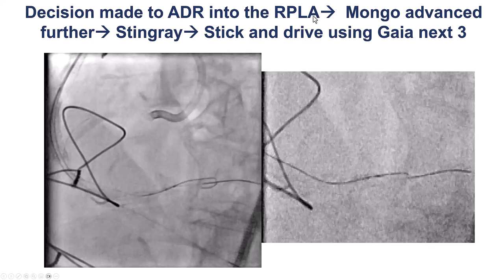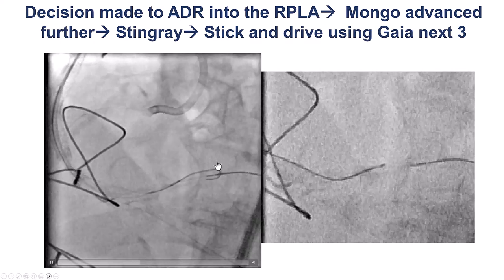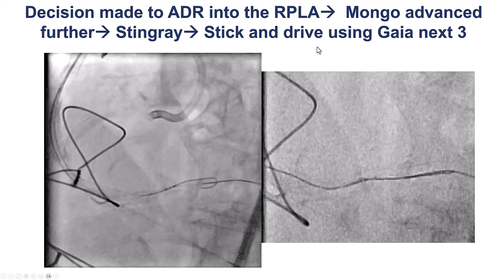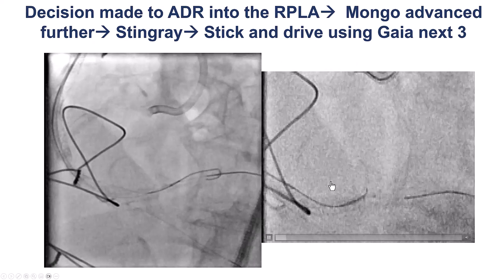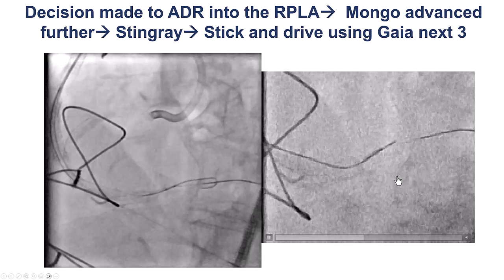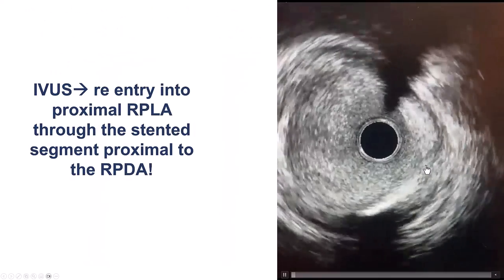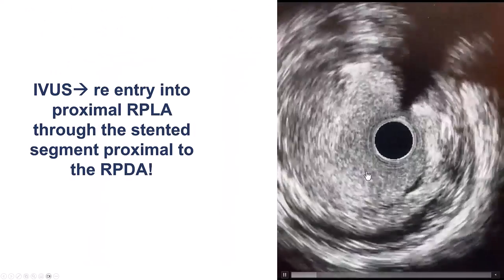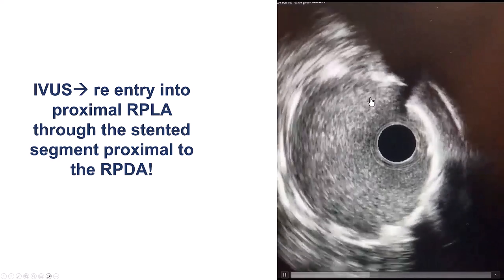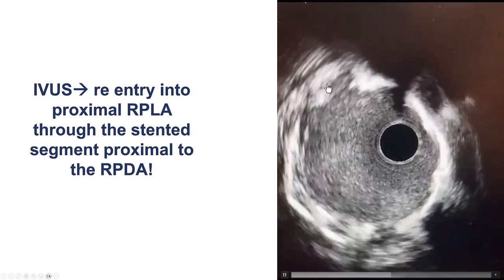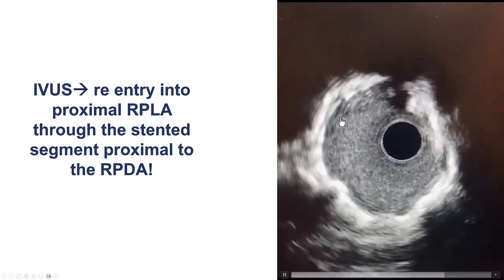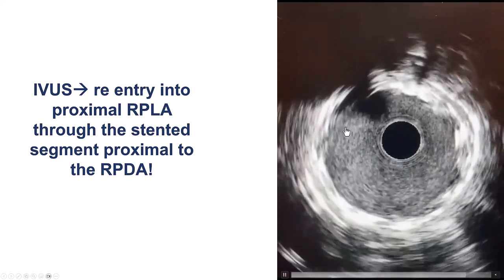Finally, we decided to do ADR into the right posterior lateral. We advanced the Mongo, did the Stingray balloon, and essentially performed a stick-and-drive using the Gaia Next 3. There was nice advancement, and now we have overlap of the wire placed there through the saphenous vein graft. We then did the IVUS, and to our great and pleasant surprise, we had actually re-entered inside the previously placed stent — not distal to it, but actually through the previously placed stent — which was wonderful.